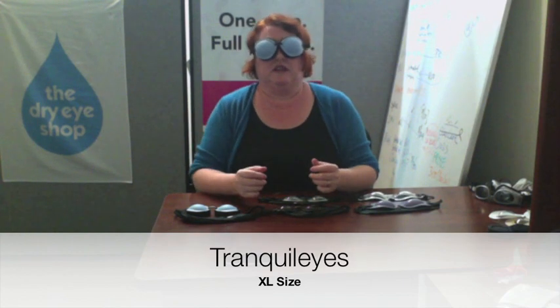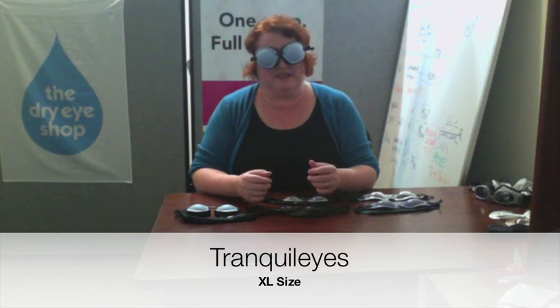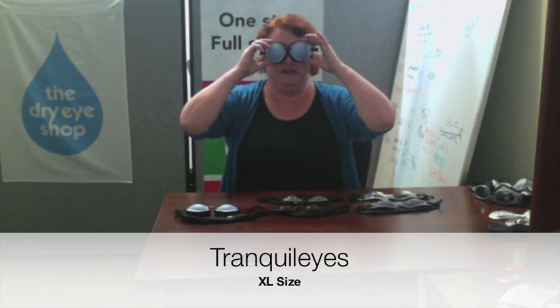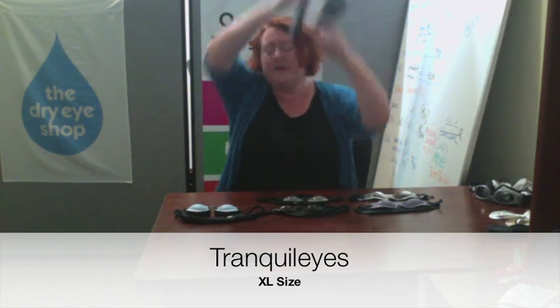It's kind of funny because over the years, I've tended to steer people away from this one for overnight just because it is so big and bulky. And then when I was having a flare-up this summer, I tried it again for the first time in a long time. I actually really liked it for overnight because of the comfort, at least as long as I'm on my back. It's just really luxurious, and I didn't feel any pressure on my lids from it. It's kind of spread out over a larger area.